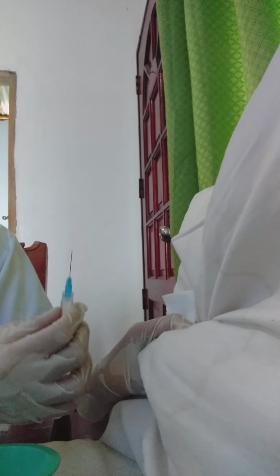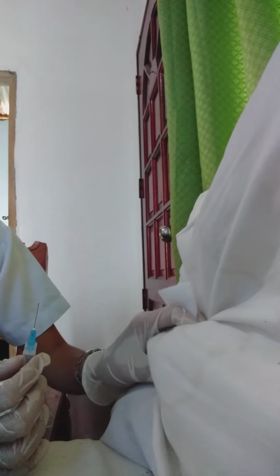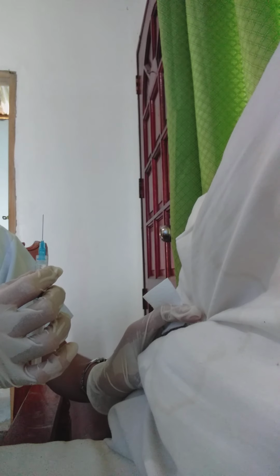Use the non-dominant hand to pinch and spread the skin. Pinch if there is less adipose tissue, spread if the client has more than 1/2 inch of adipose.